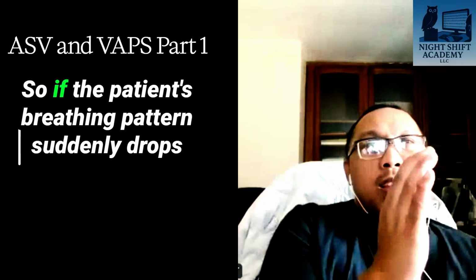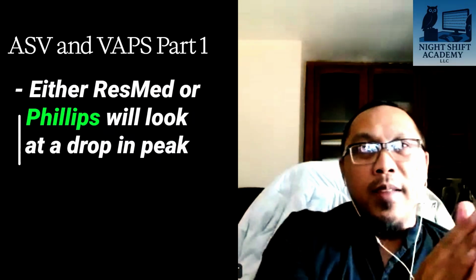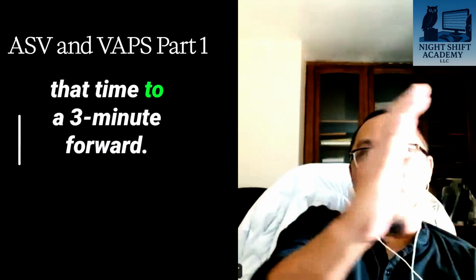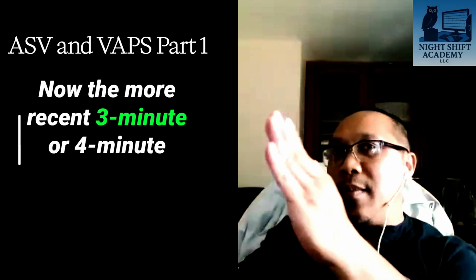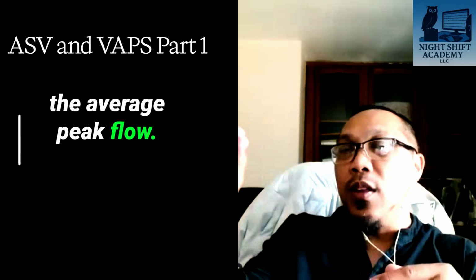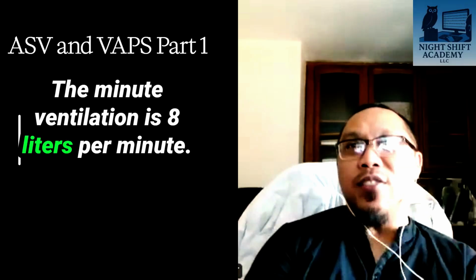It follows the patient's breathing pattern. So if the patient's breathing pattern suddenly drops, either ResMed or Philips will look at a drop in peak flow or minute ventilation. When you turn lights out, it starts from that time to a 3-minute window forward. Now, in the more recent 3-minute or 4-minute window, it will always look for the average minute ventilation or the average peak flow. The minute ventilation is, let's say, 8 liters per minute.